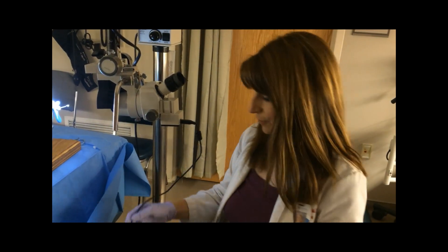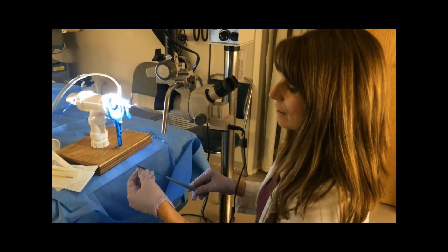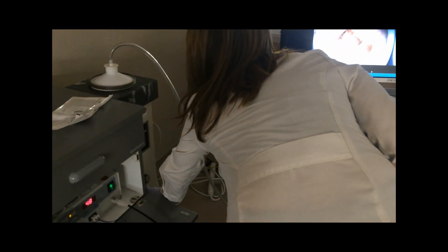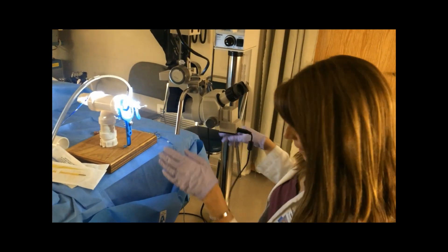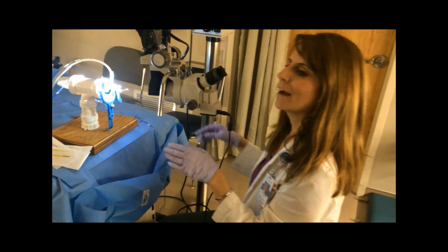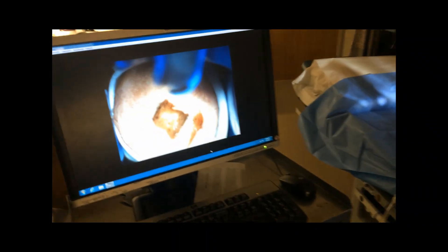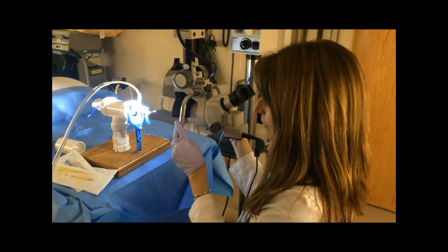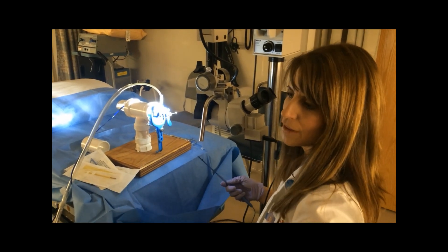The next thing that I do when I'm ready to actually start the procedure is turn on the vacuum. I make sure that I can see the entire area that I need to see. I do not look through my scope while I'm doing this procedure — I look off to the side of it. I do try to keep it visualized for the rest of the learners in the room.